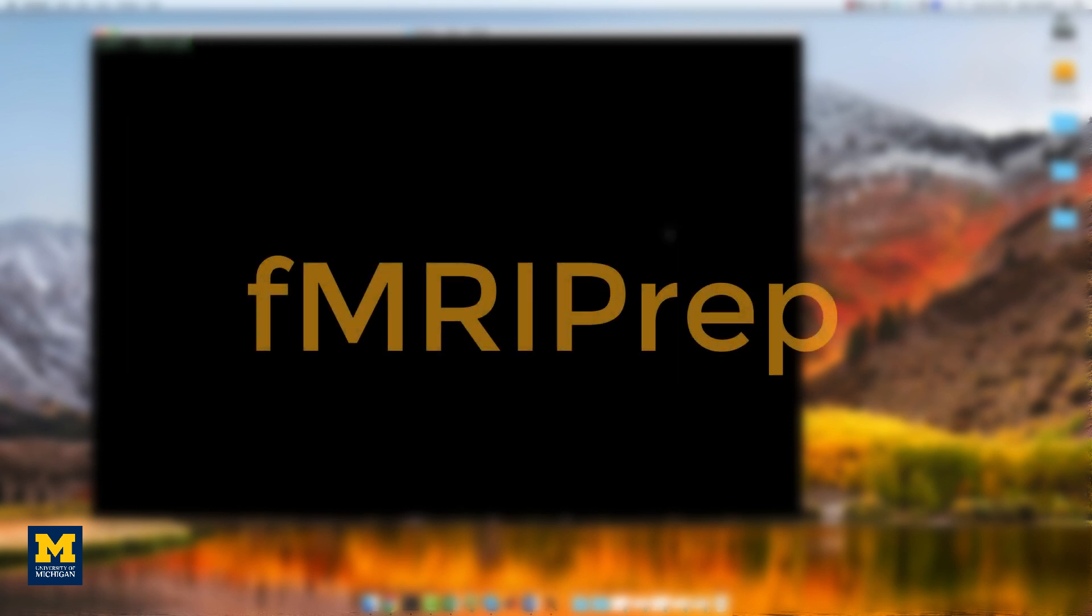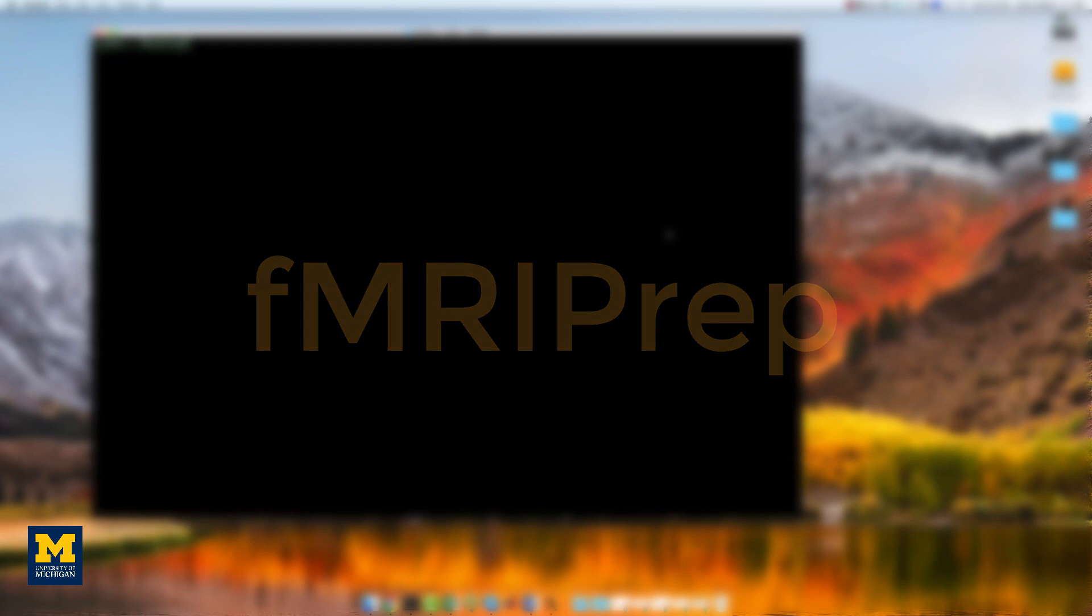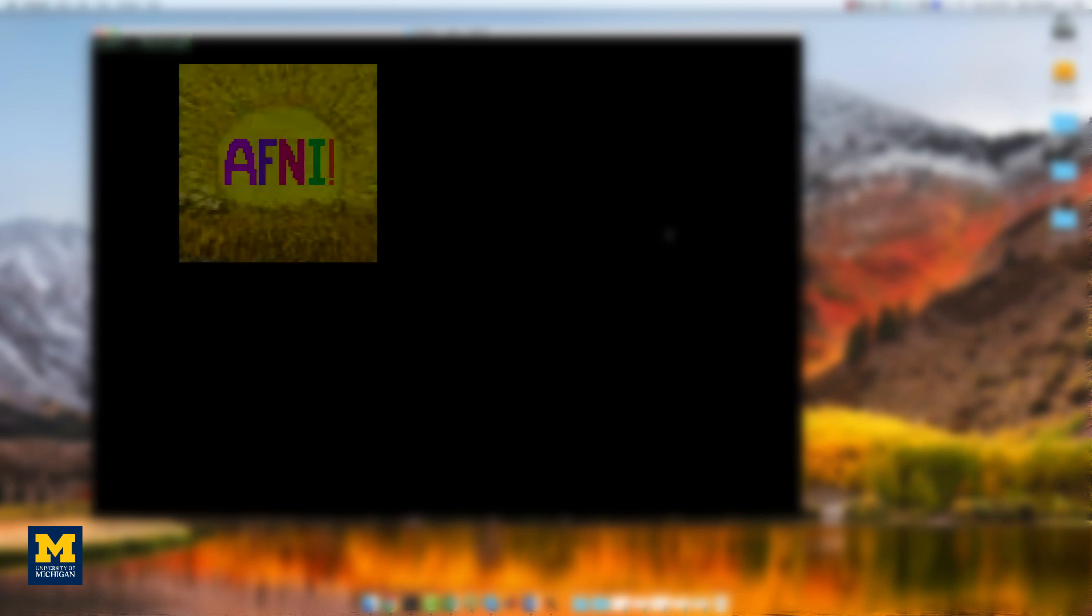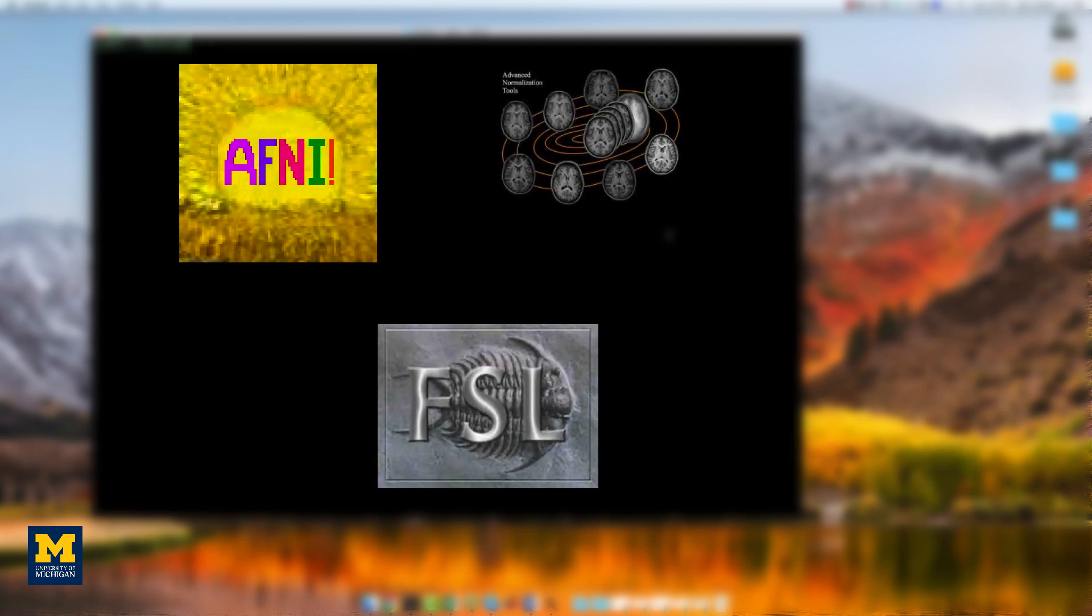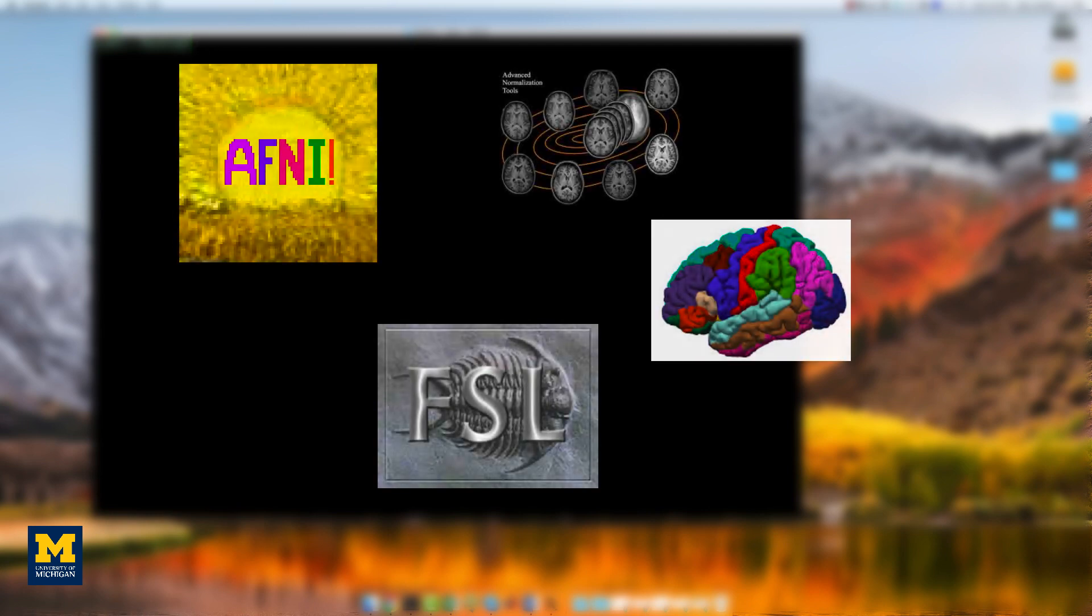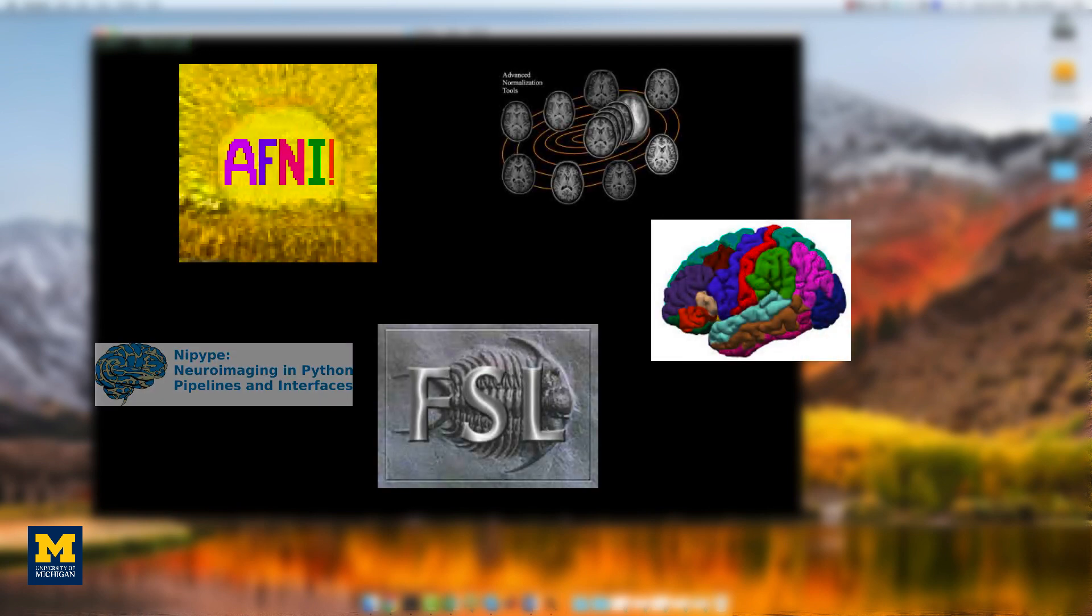We can do this with fMRIPREP, a software package that uses standardized preprocessing on BIDS-compliant fMRI data. This pipeline uses tools from different fMRI software packages, such as AFNI, FSL, ANTS, FreeSurfer, and Nipipe.